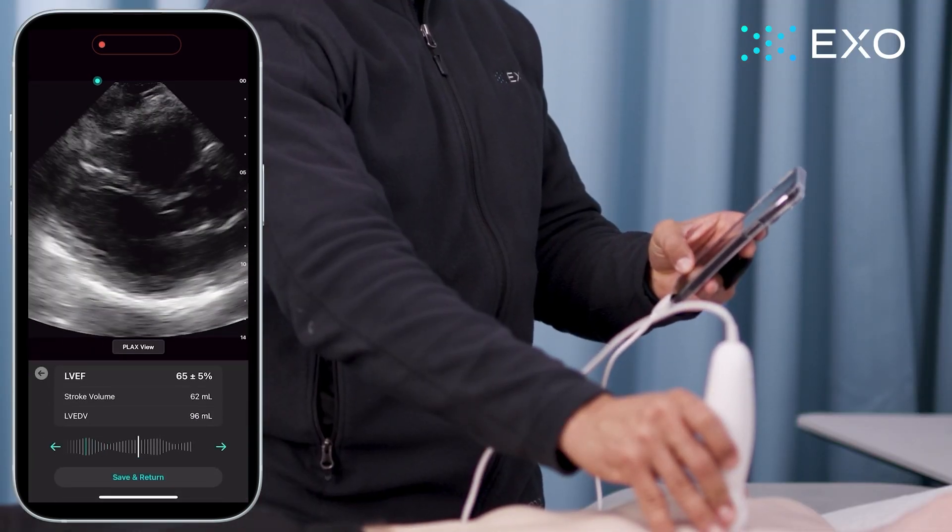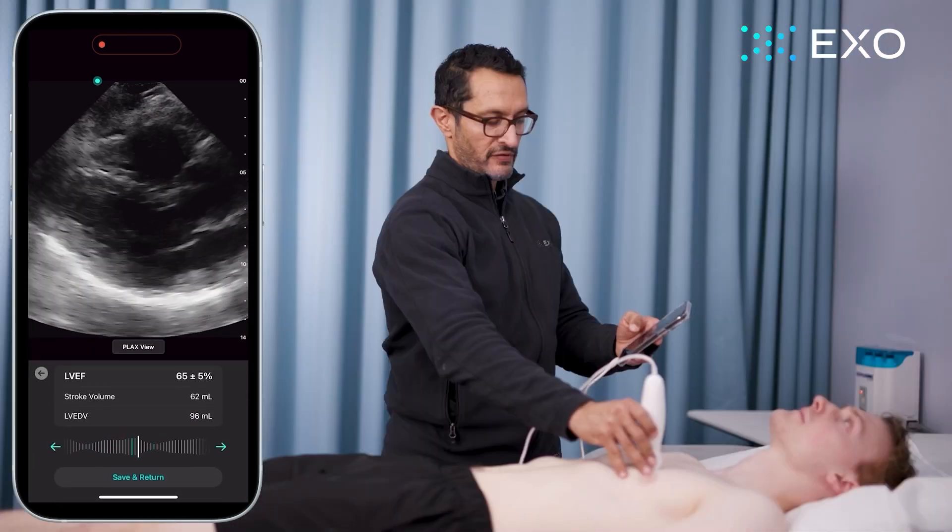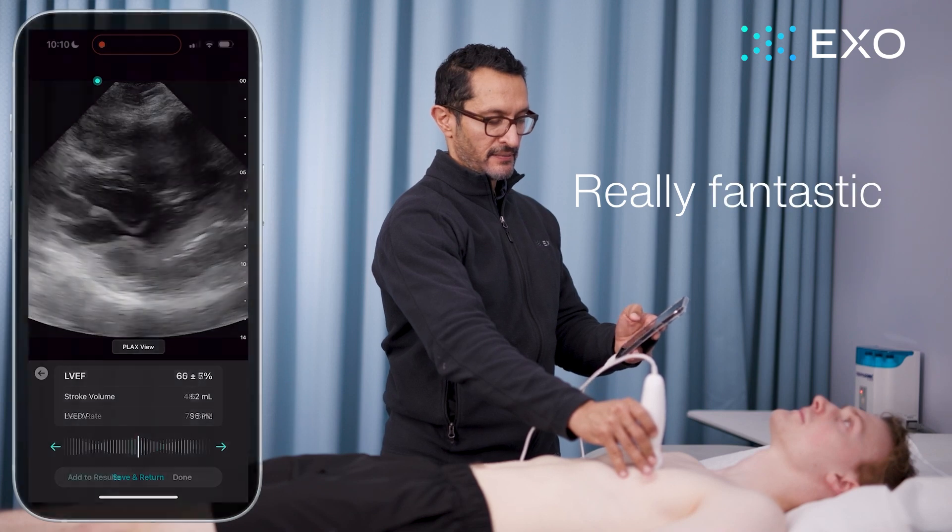It also allows me to scroll back and forth to review my imaging. Really fantastic. The next view I'm going to go to is the apical 4.